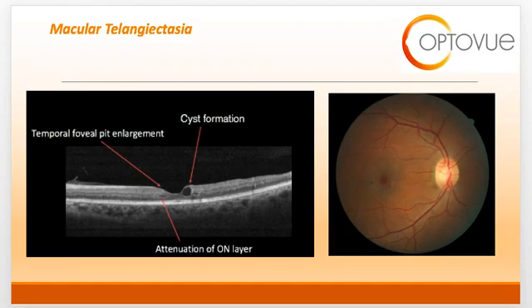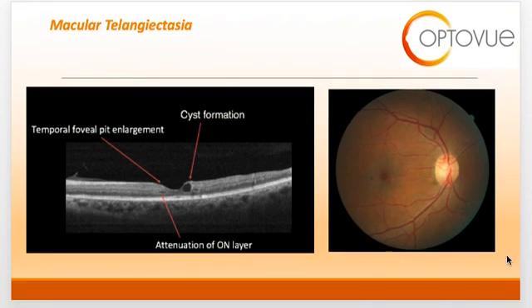On the left-hand side, you can see the early OCT signs of MAC-TEL. These include temporal foveal pit enlargement secondary to loss of the outer nuclear layer and ellipsoid zone, that eventually can progress into cavitations or cysts on the superficial part of the OCT scan. You can see on this scan that I have delineated the cyst formation, the temporal foveal pit enlargement, and the attenuation of the outer nuclear layer.